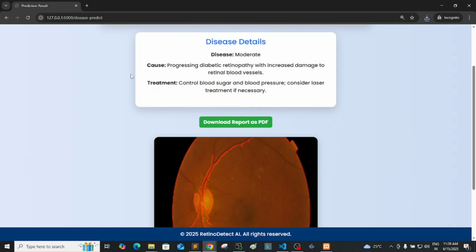Now we will be discussing entirely how we coded, what is there in this web application, one by one. But before that, we will try to understand what diabetic retinopathy is, and then understand that there are already some IEEE papers, what they did, what their existing system is. Once we understand their existing system, we will define our methodology. Once we define our methodology, we need to prove it is better than the existing system. We will do that with the help of accuracies and losses. We'll do these things one by one, and finally I will let you know how we coded and what codes I used. Okay, clear? Don't skip the video, please watch until the end, and you will get so much information about this.